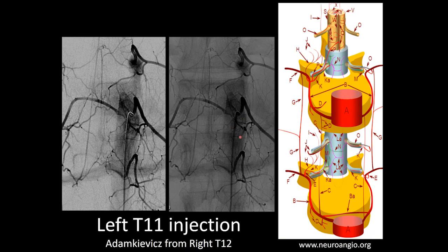So what happens here is that by injecting the left T11 segmental branch, we fill the right T12 segmental branch, which is here, through anastomosis. And the anastomoses, as we said, run up to down, but they're also left to right. And once the right T12 branch is filling, then we see the contribution to the Adamkiewicz artery, which is this one, the dominant radiculomedullary artery supplying the anterior spinal artery.